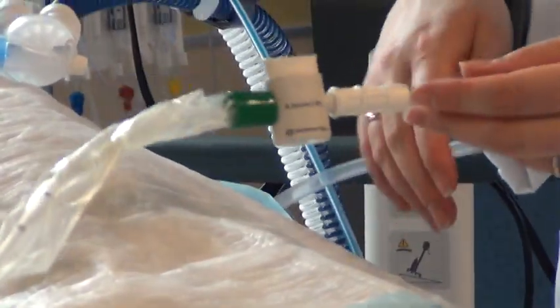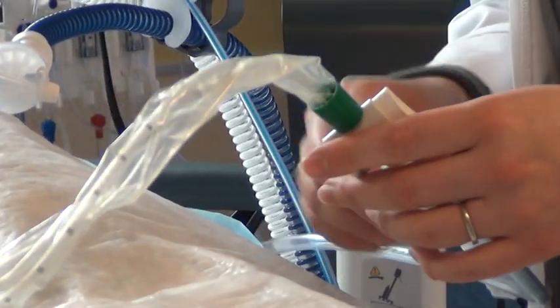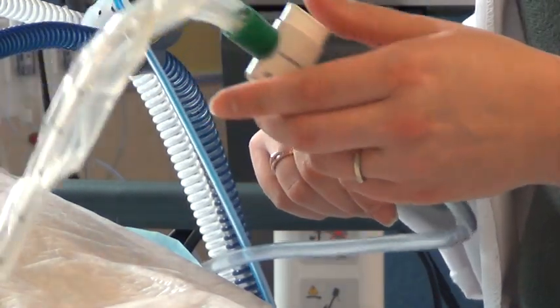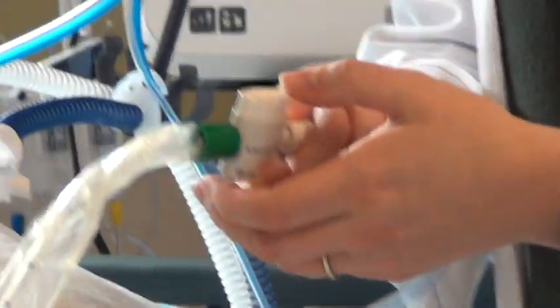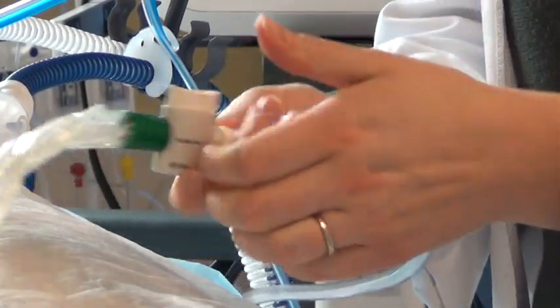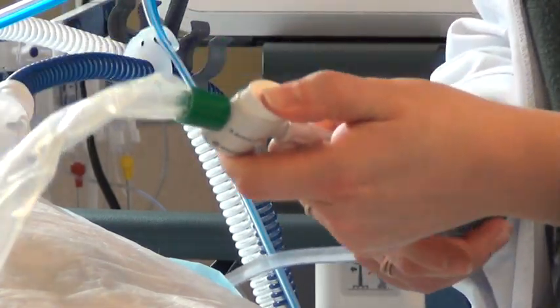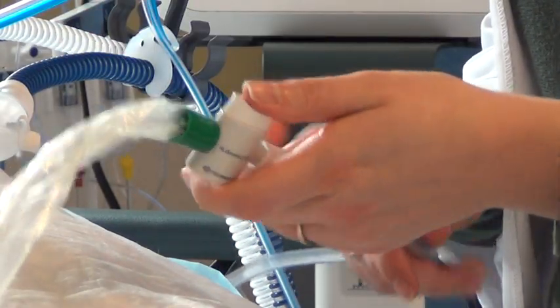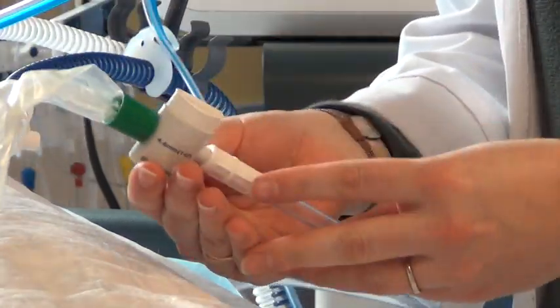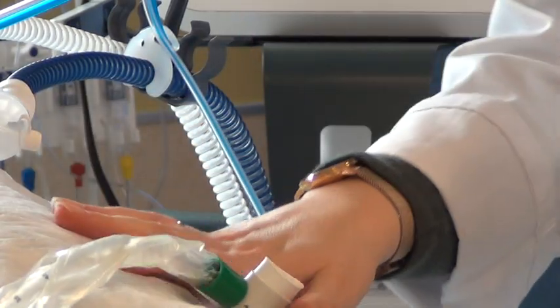So the way that we suction, which is one of the roles of the nurses in critical care, if ever for any reason there's too many secretions, this is how we would do it. There's a button here where I could press down right now. If I were to turn it, this would be locked. So this should be locked most of the time, generally speaking, when you're just caring for your patients or they're just in bed. When you are ready to suction, however, we would unlock this button here.